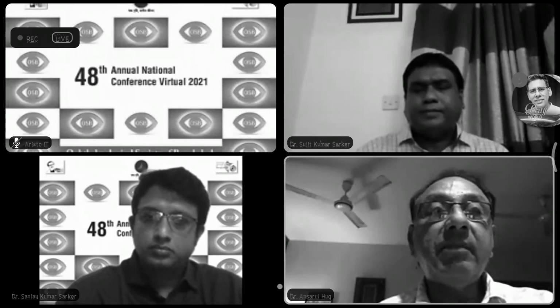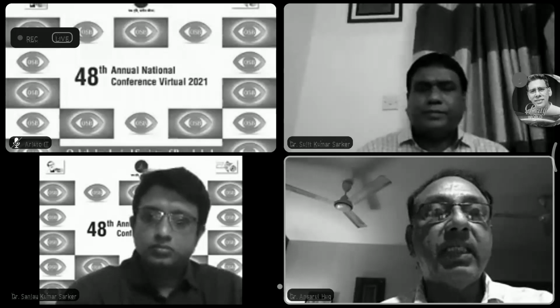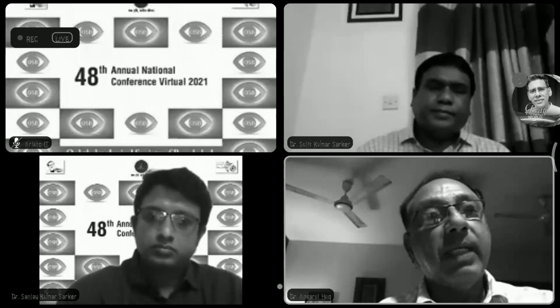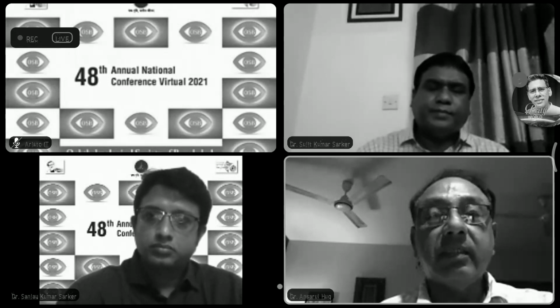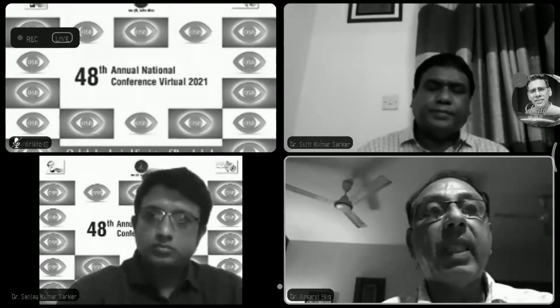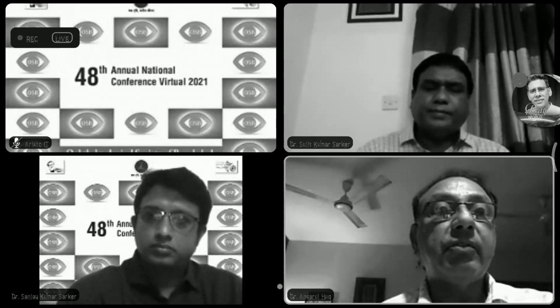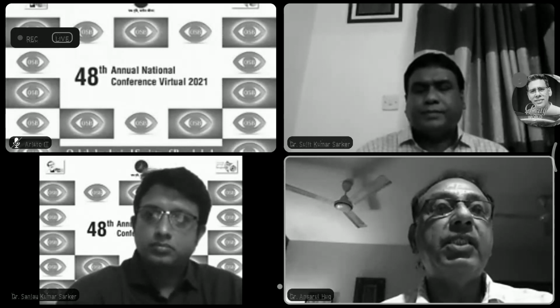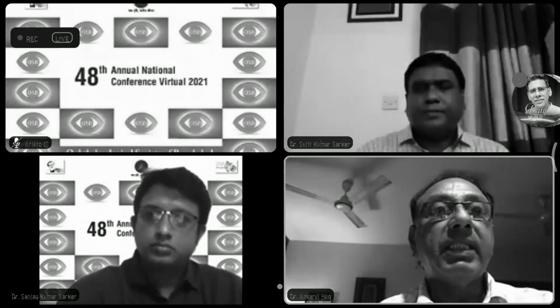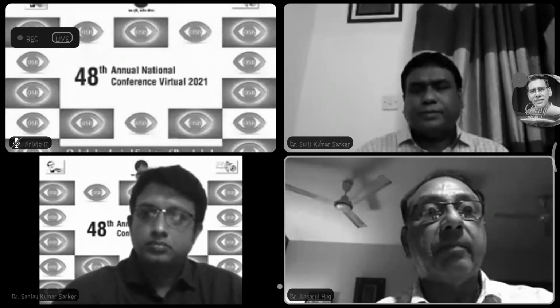Because of this limitation, ICG came to visualize the choroidal circulation. This combination of choroidal and retinal angiograms is still used. They will remain in use till we get a better angiogram or a better imaging technique in the future.